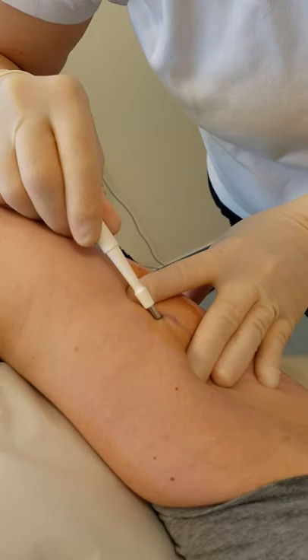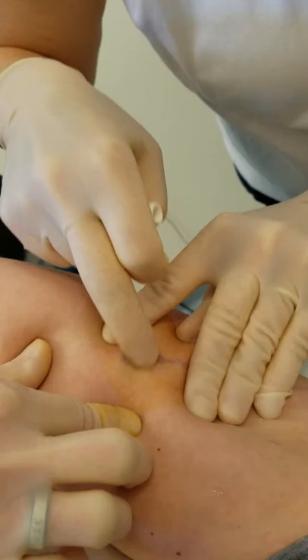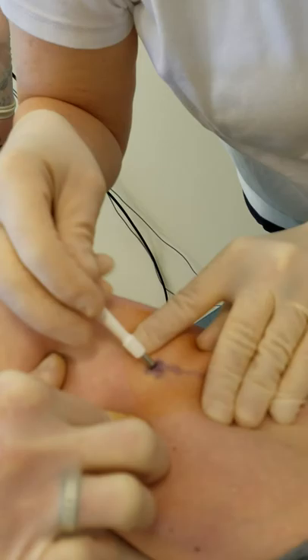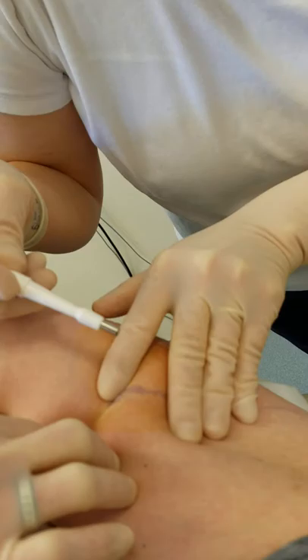I have a number four punch and I'm putting this in at about a 45-degree angle to the Nexplanon. Again, you want to palpate and see where that Nexplanon is. Take a couple of minutes just to make sure — and don't move it, because then you'll move the Nexplanon.